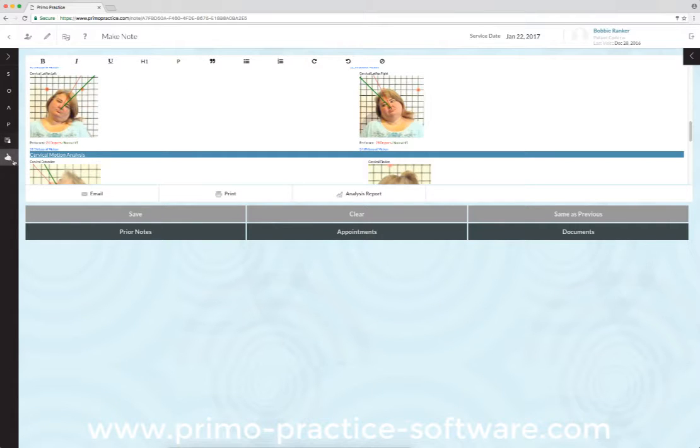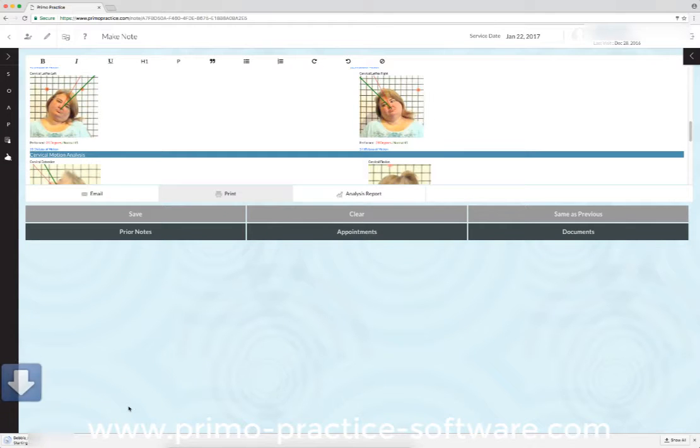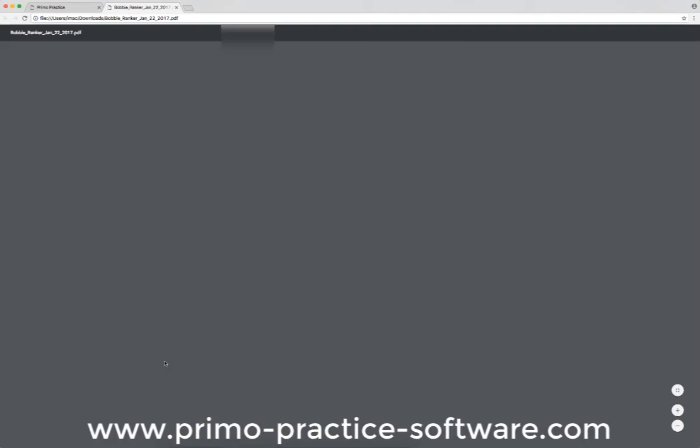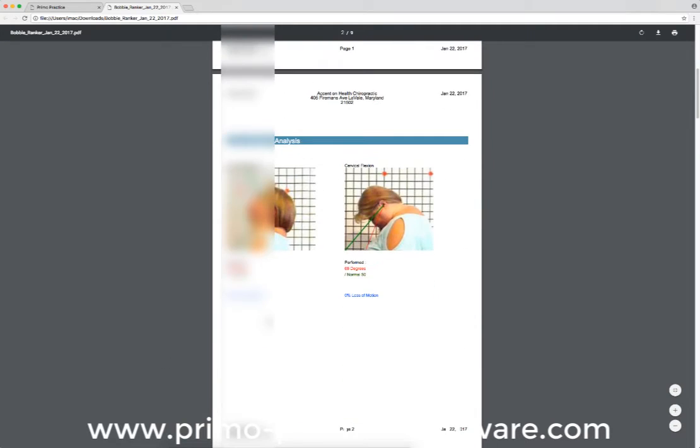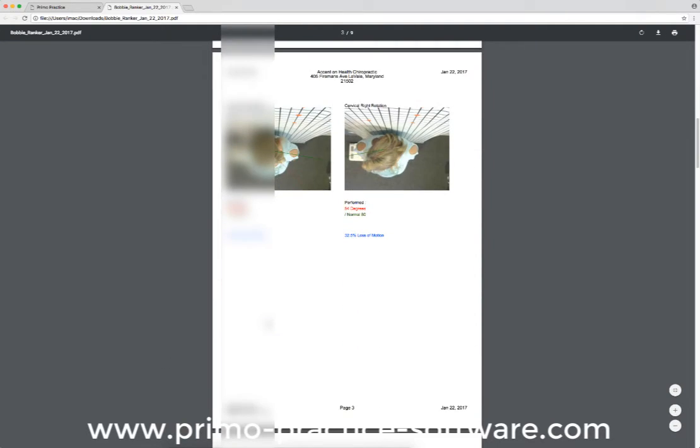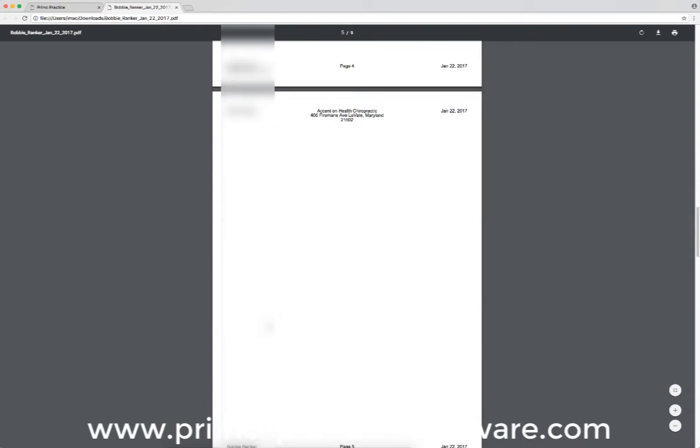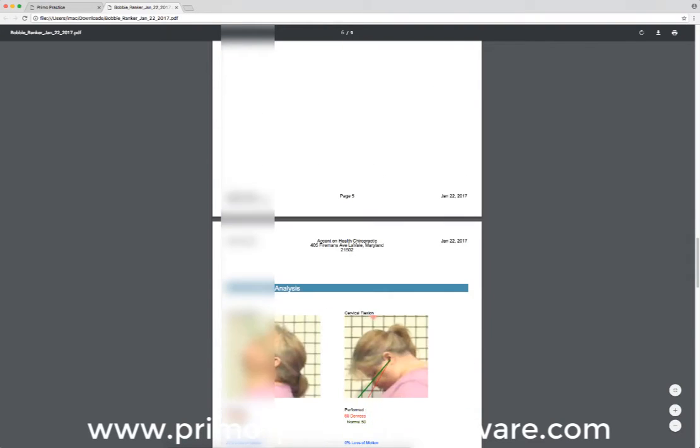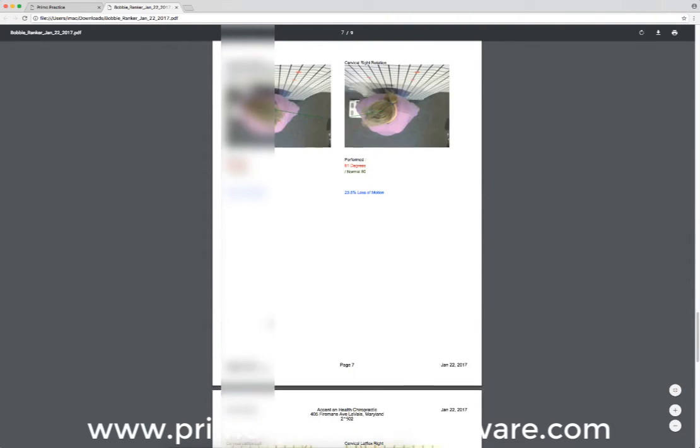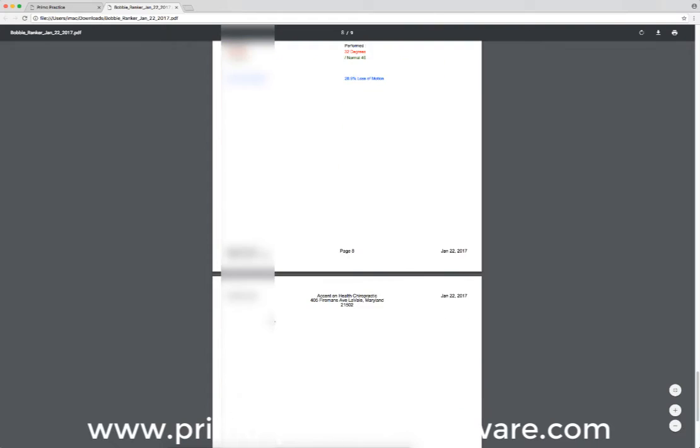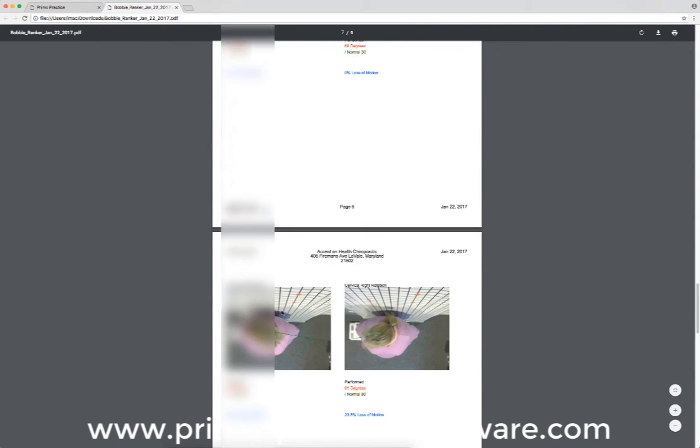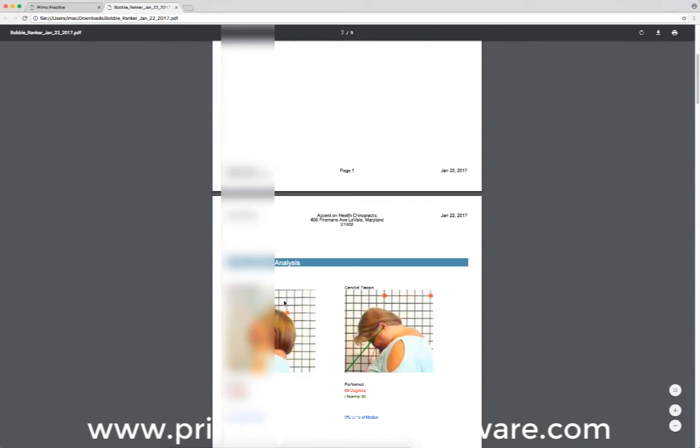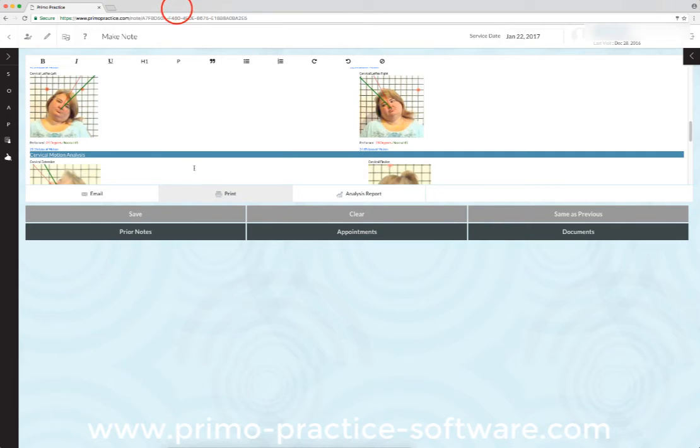If I'm going to jump ahead to print, so if we go to print and look at this analysis when it creates it, I now have a report that's going to show all of her cervical range of motion studies compared to her initial range of motion studies. So that becomes part of her file, part of her chart.